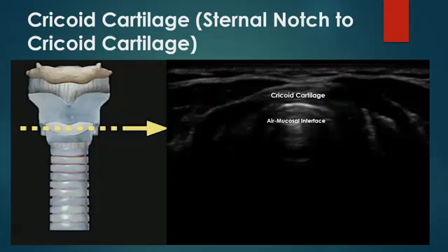In this particular view, we're looking at the cricoid cartilage, which is best seen as we move cranially. It's shown sonographically as a C-shaped mixed echoic structure, much thicker than the tracheal cartilages, with a similar hyperechoic strip line of air mucosal interface directly beneath it. The cricothyroid membrane should be seen a little bit further down, but you see this same comet tail strip here, which is very familiar, looks very much like the tracheal cartilage.